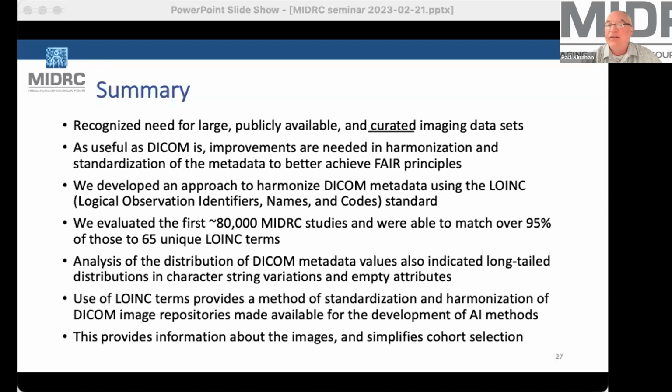We have a kind of handy list. It's our working list of things that we've used repeatedly, sort of ordered by body part or body region, and modality. And so far, it's turned out we haven't needed any. But it's surprising, even with this relatively short list, how many combinations we need, such as abdomen, pelvis with contrast. Could be something that somewhere has just never come up, but we haven't hit that one yet. But we're ready. We also had a preliminary discussion with the Regenstrief group to say, look, if we find something, can we propose it? And they're welcoming our participation.